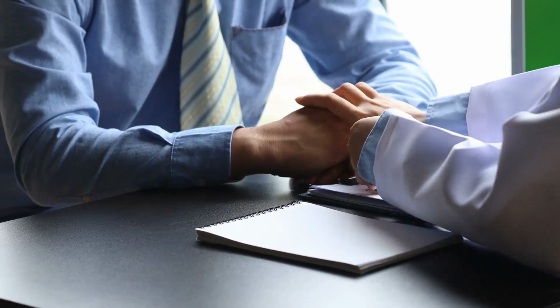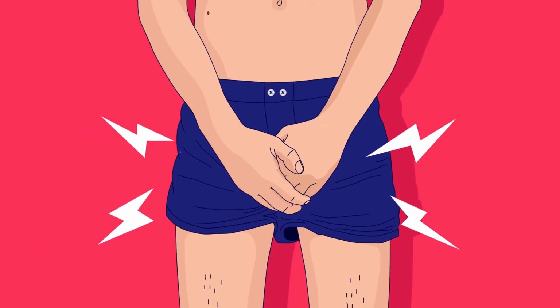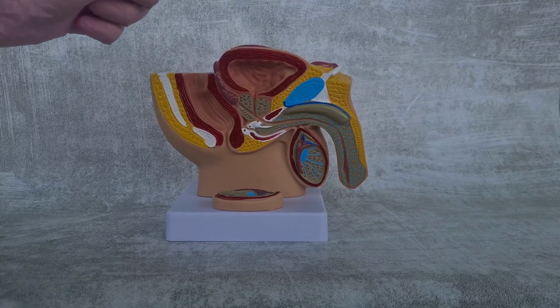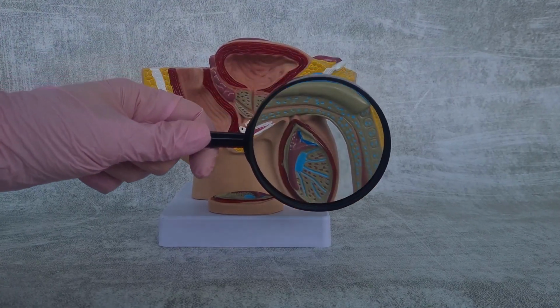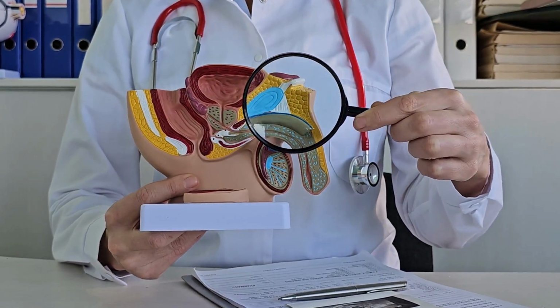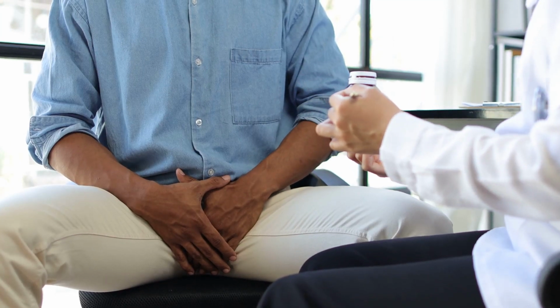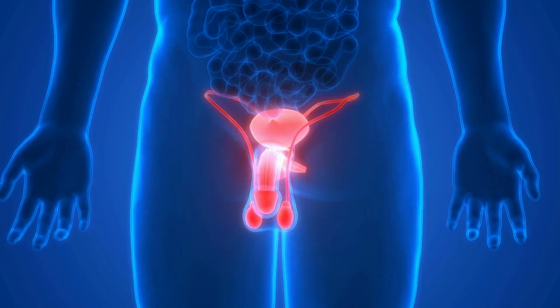Of course, like any medical procedure, there are risks involved. These can include infections, implant malfunctions, or even a loss of sensation in some cases. Let me explain in more detail the potential complications that you need to know before proceeding with a penile implant. Infection rate, up to 3%. We do everything to avoid infection: special genital cleaning and antibiotics before, during, and after the surgery.